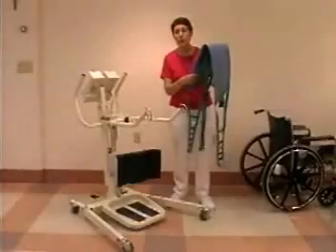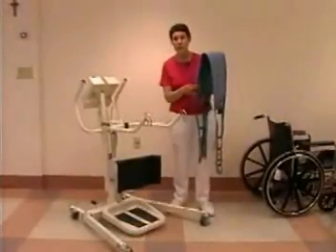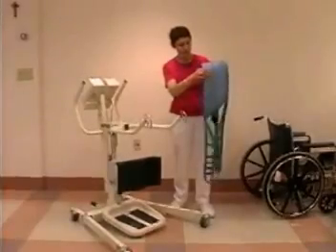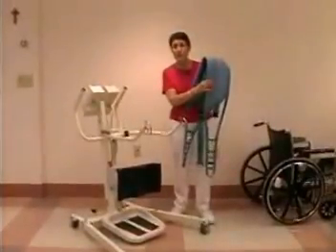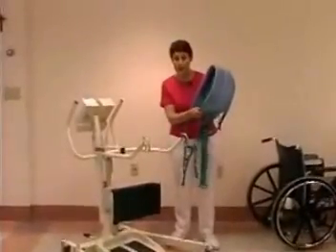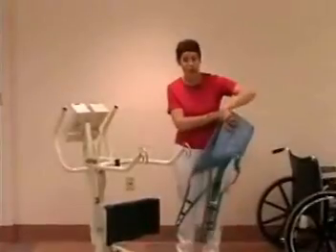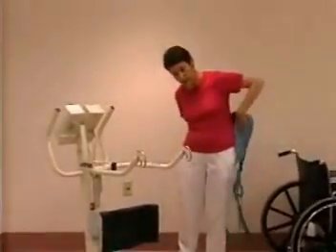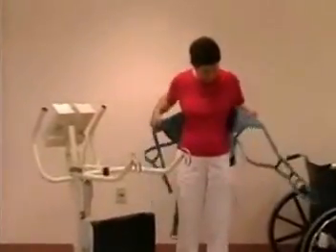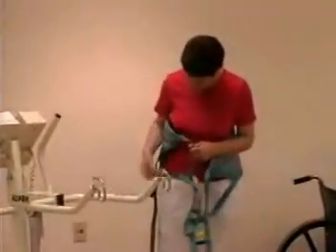Next, I'm going to show you the sling that's attached to the lift to help lift the patient into the standing position. The sling should be checked before each use to be sure that it's intact and in good condition so that it's safe for us to use on the patient. The sling wraps around the patient in this manner. There is a safety strap that can be secured.